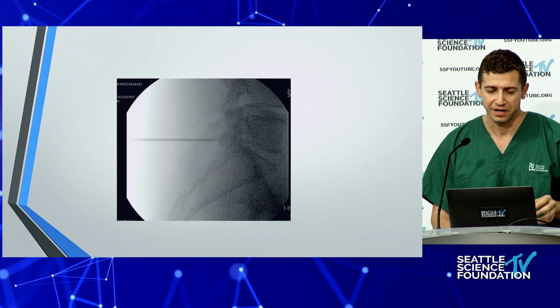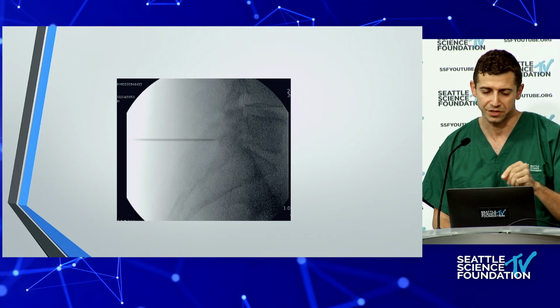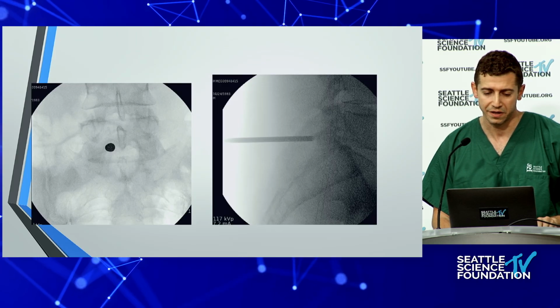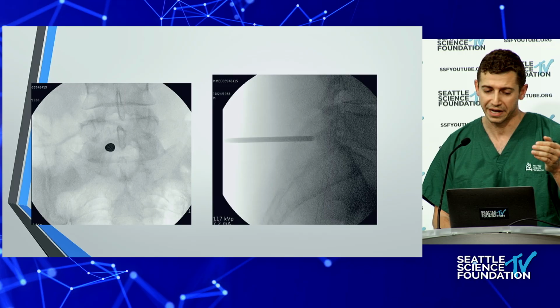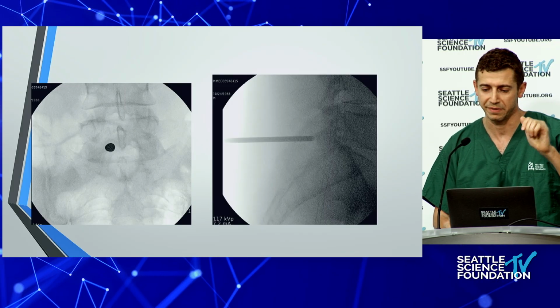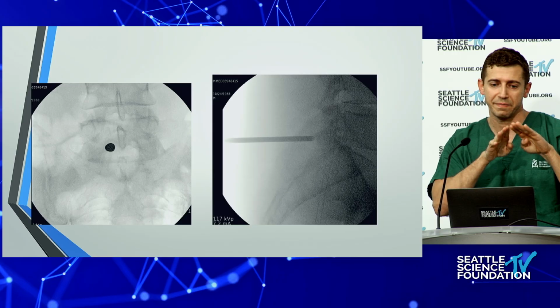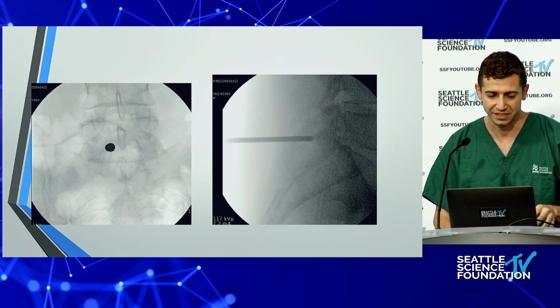Then you get your dilator, and I like to start with a lateral because I'm always afraid of plunging. So I just go under the lateral to get to the bone there, the bottom aspect of the L5 lamina. You check on the AP, and then you start putting your expanding dilators, again, right on top of the bottom aspect of the L5 lamina, right where it touches the ligamentum. There's a point where you feel the bottom edge, so you feel that you're bouncing on the ligamentum, and then you feel like you're on bone. That ligamentum-bone junction is the ideal place to start for these interlaminar discectomy cases.